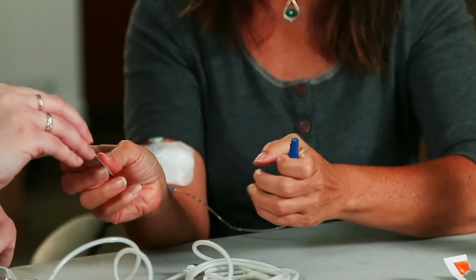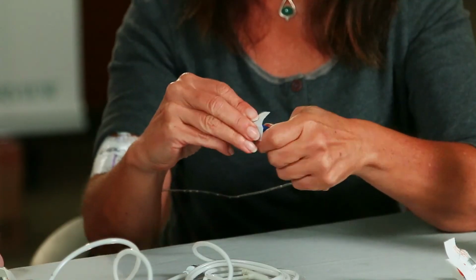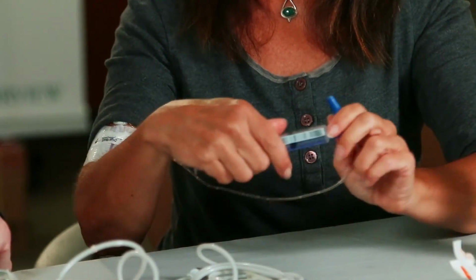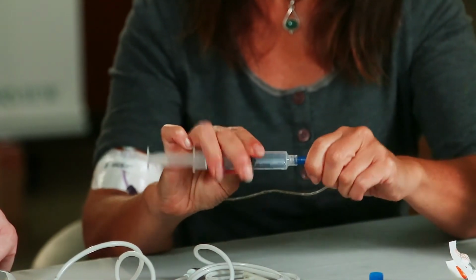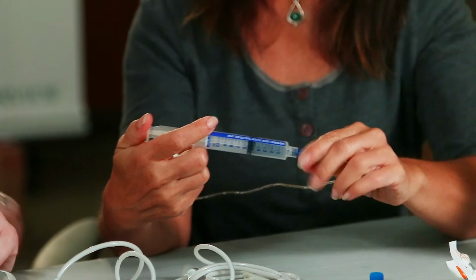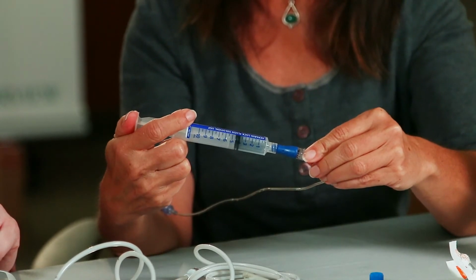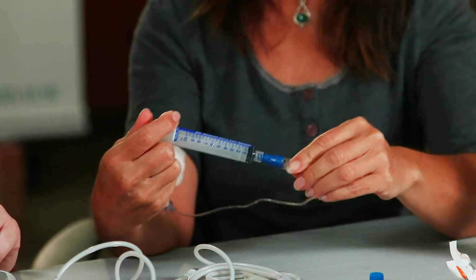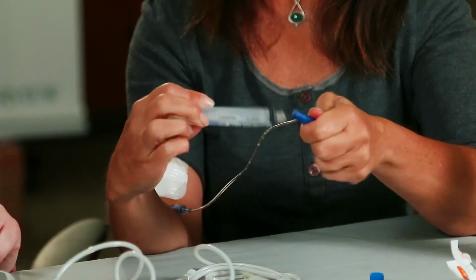Using a fresh alcohol pad, re-scrub your needleless connector for 15 seconds using good friction and scrubbing motion. If your line needs heparin, flush with the final heparin. Undo the clamp of your line and flush using the pulse method. Push stop, push stop. Reclamp your line if your line has a clamp and disconnect the syringe.